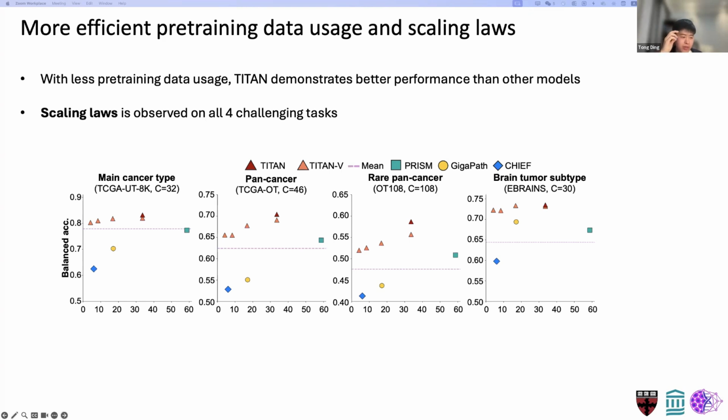It's mentioned very explicitly in, for example, the GigaPath paper that their pre-trained slide encoder is for fine-tuning use, and their pre-training just makes your fine-tuning perform better. Chief is the same way in their evaluation, and we also asked them on their GitHub issues, and they said that Chief is also not built for linear probing use.